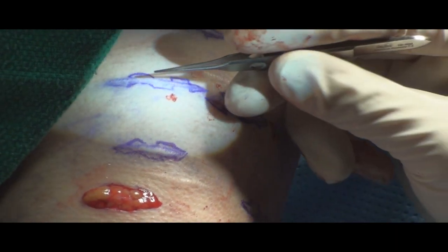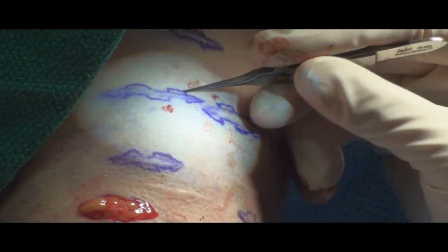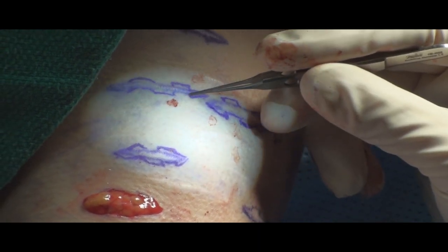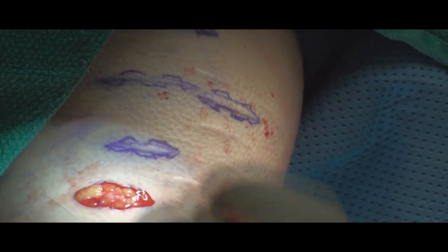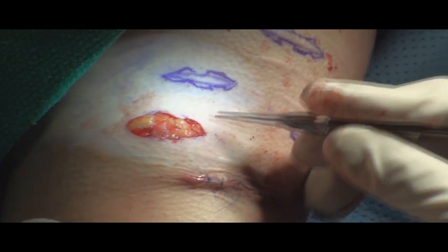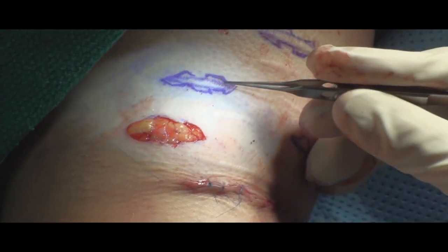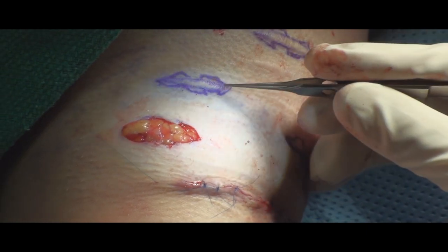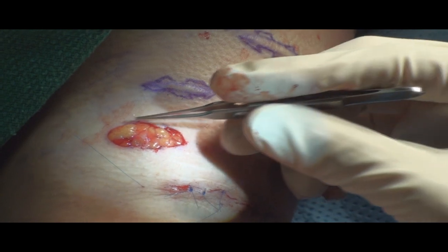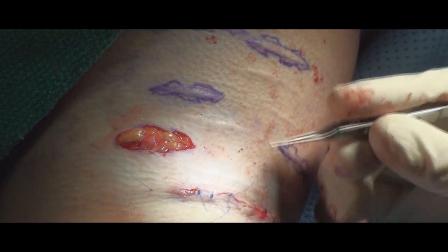And this is what that's demonstrating. Here's a half circle. Here's a square with this long scar and a coinciding matching pattern. And this is just showing us in the process of doing that. This was originally a scar that was this length, and we took out the pattern and then we're going to close it.